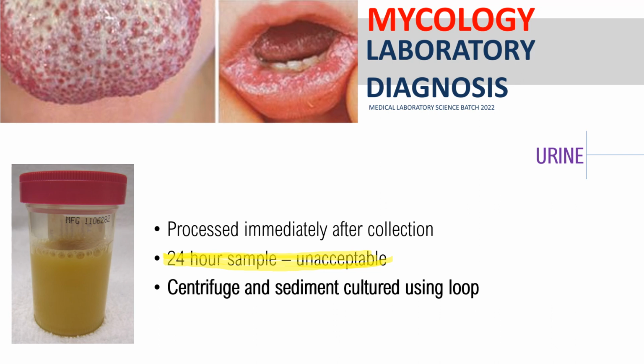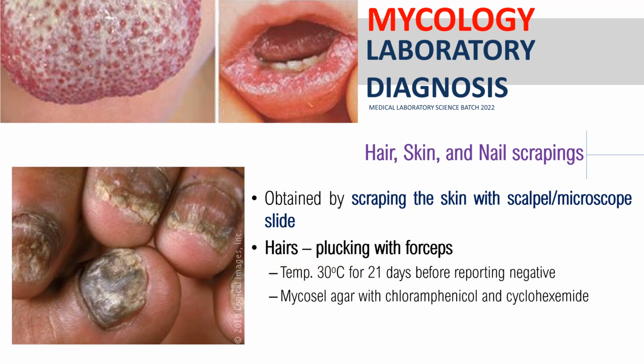Kaya ito yung sabi ni Bailey and Scott, class, na dapat pag nag-centrifuge ka, ang gagamitin mo is ang sediment. Okay? Ang sediment, class, hindi ang supernatant. Okay? Pakitandaan, class, pag mag-centrifuge ka, anong gagamitin mo? Tama, sediment, class. Next, class, is your hair, skin, nail, and scraping.